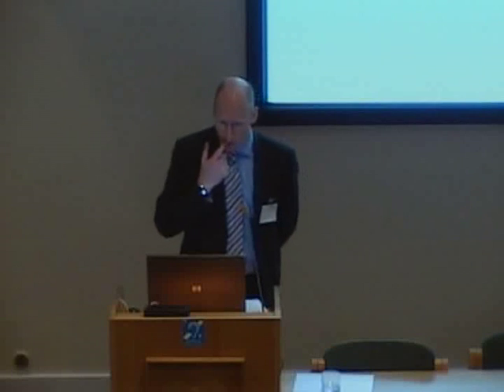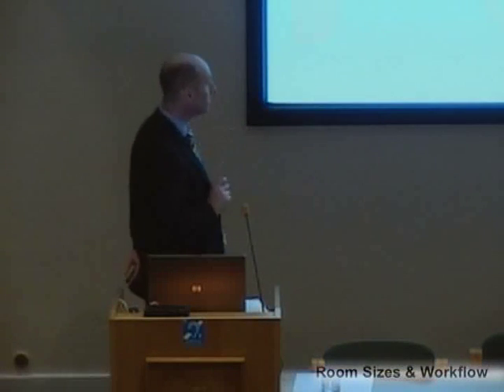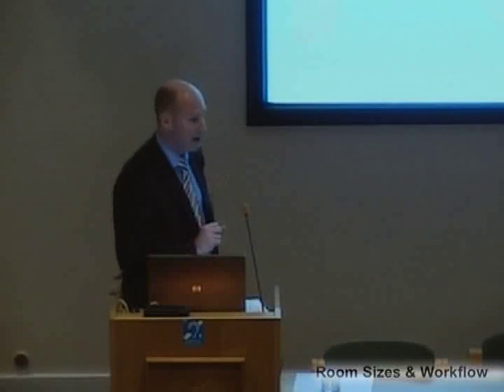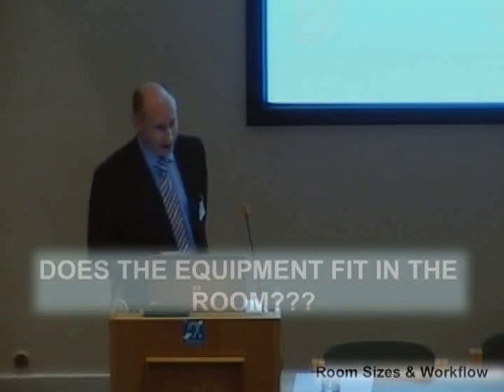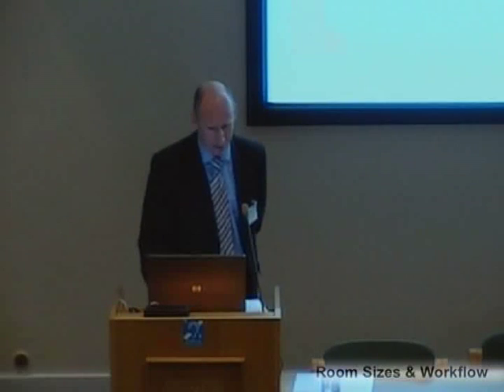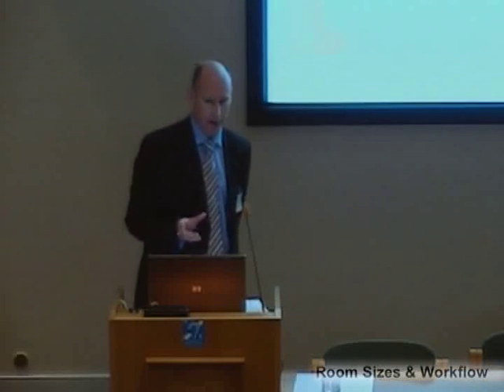So I thought I'd start with room sizes and workflow. This is the intriguing question that I get asked pretty much daily, if not hourly: does the equipment fit in the room? Well, strangely enough, the simple answer is 9 times out of 10, yes, the equipment does fit in the room. The problem is that we tend to forget about the ancillary equipment that's going to go in there.